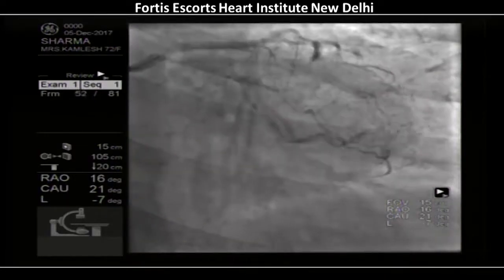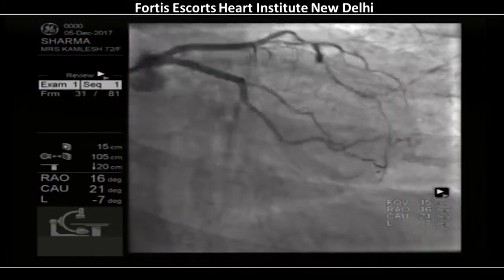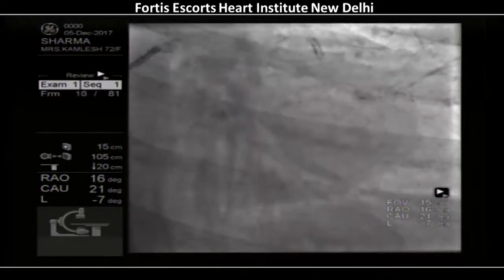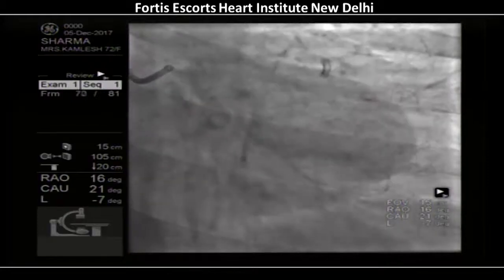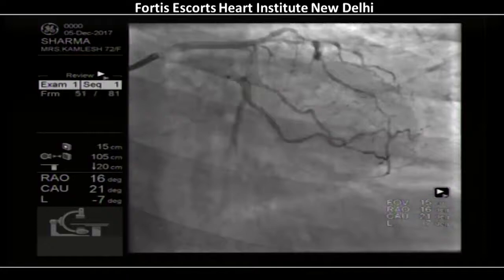All right, so let's take a poll. If this is the problem, how do you deal with this? Patient comes back after a 2.0 stent in a distal circ post dilated 2.25 with symptoms. What do you do in this case?